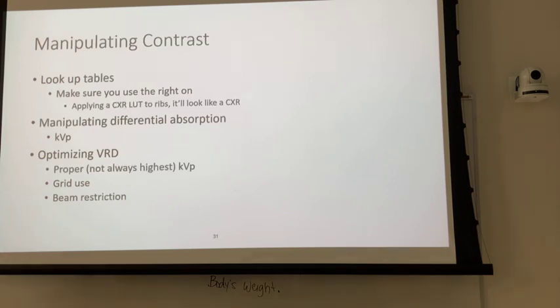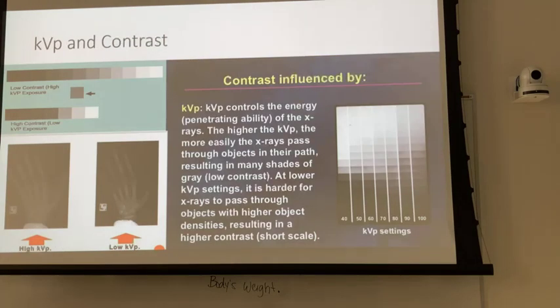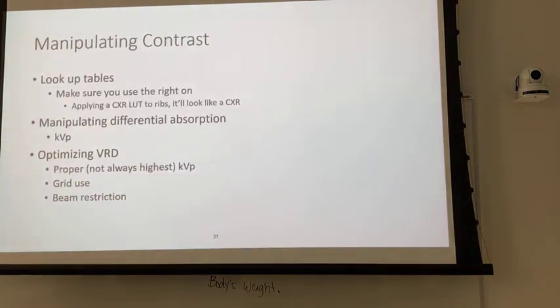Okay. Chances are you'll be able to see some, but it won't be as dramatic as chest X-ray versus hand. It's just not going to be that dramatic because your computer algorithm is probably going to even out those tissue density differences.